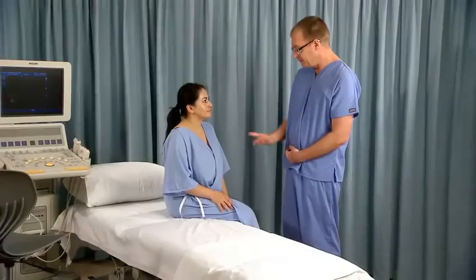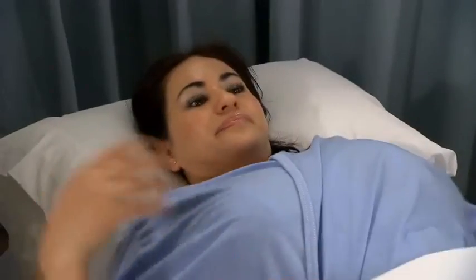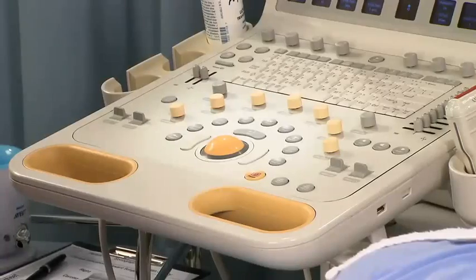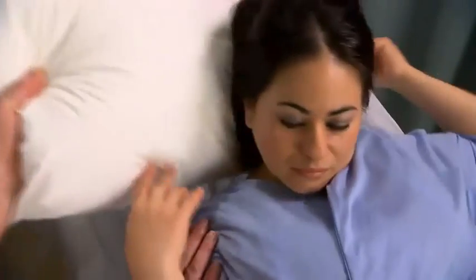Explain the technique of swallowing to the patient, as it will be done during the ultrasound procedure. Ask the patient to lie supine on the examination table and make them comfortable. Sit or stand on the patient's right side with the ultrasound machine to the left upper end of the examination table. Place a sponge, small pillow, or rolled towel under the patient's neck and shoulders.